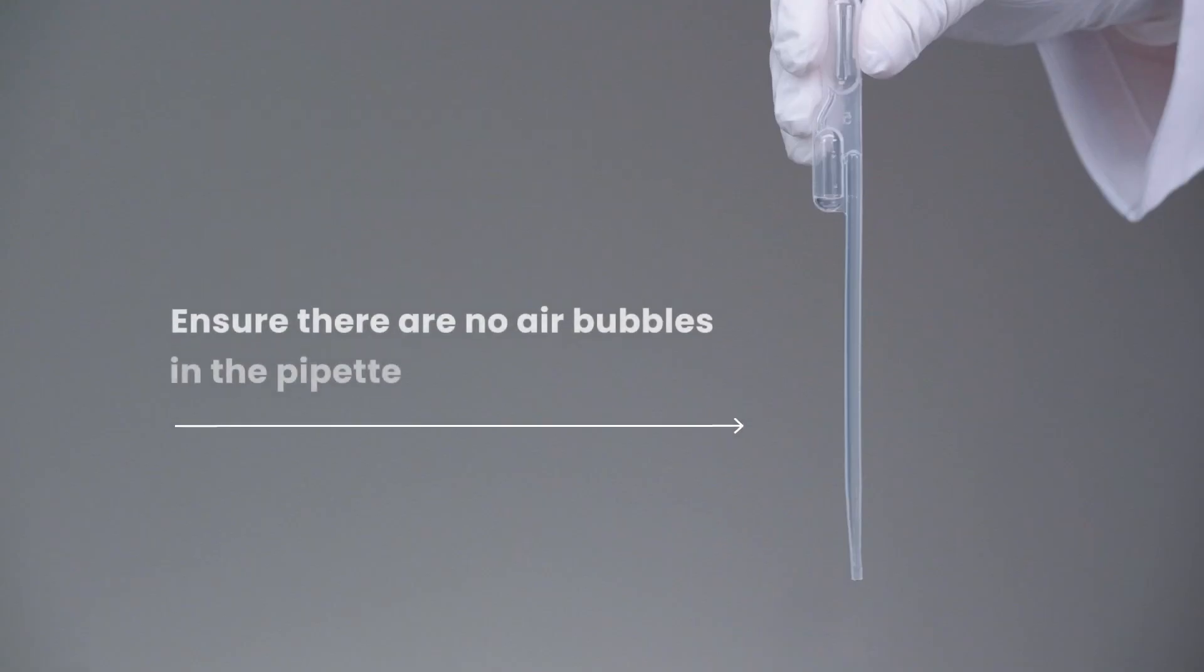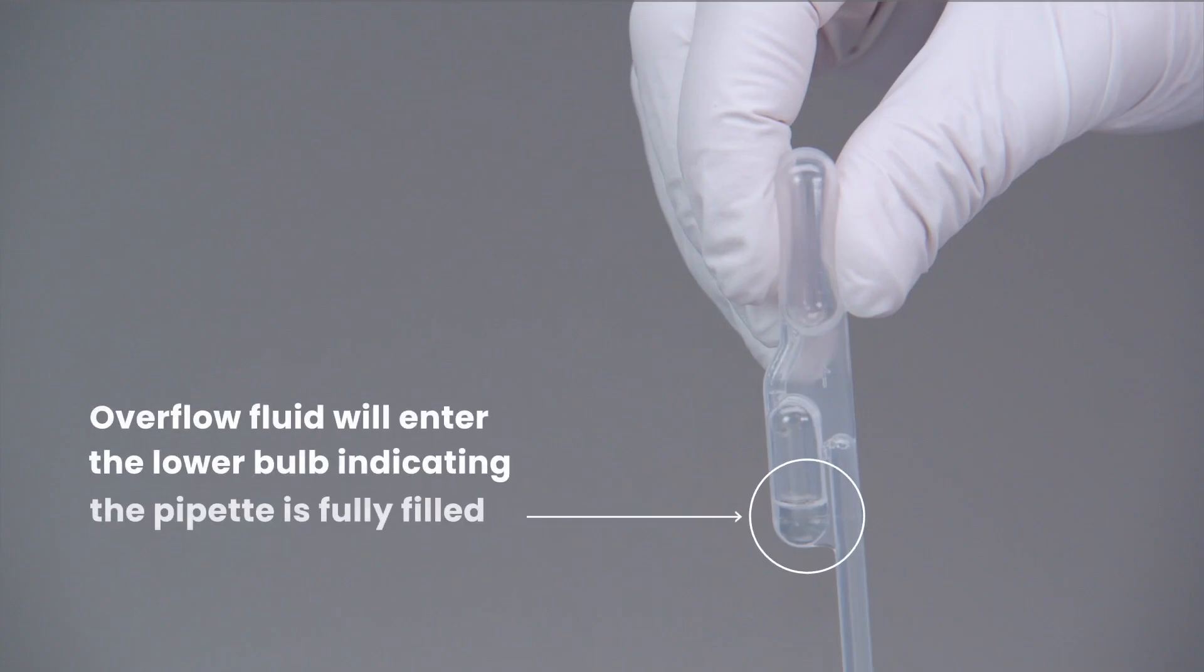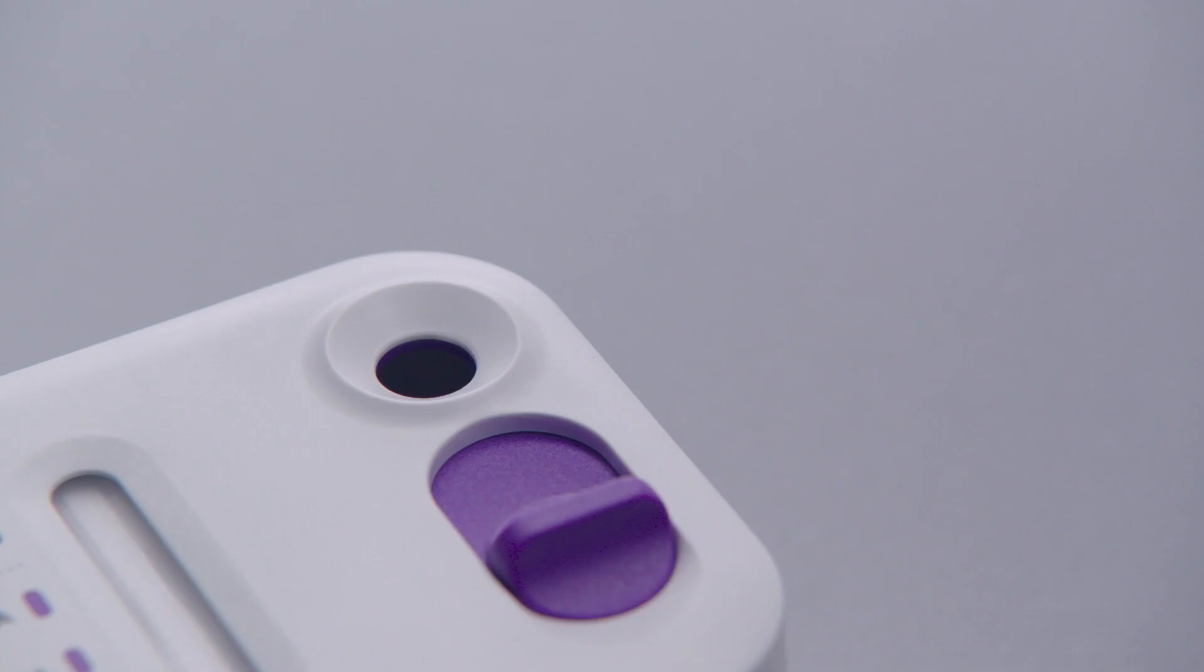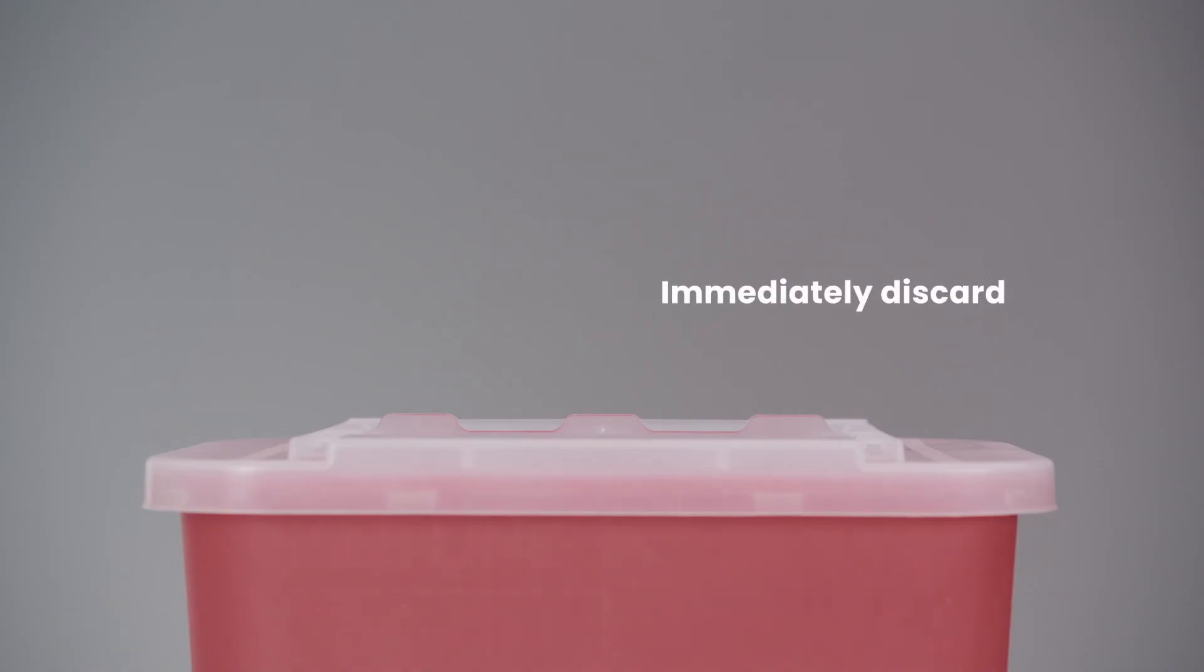Ensure there are no air bubbles. Overflow fluid will enter the lower bulb, indicating the pipette is fully filled. Insert the pipette tip into the sample port and squeeze the upper bulb to add the fluid. Do not set the pipette down. Immediately discard it according to your institution's guidelines.